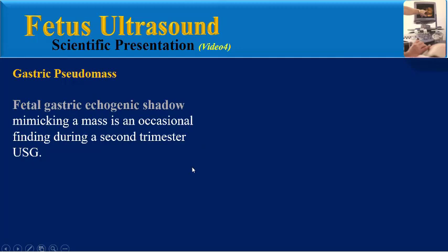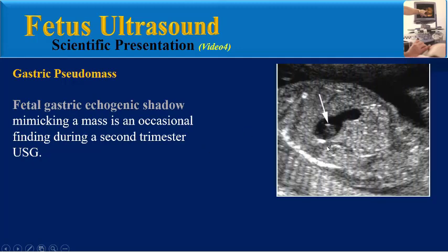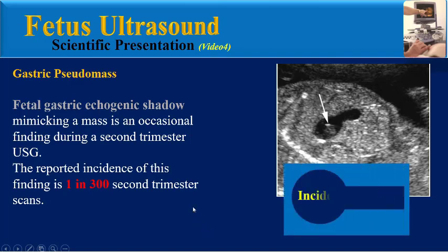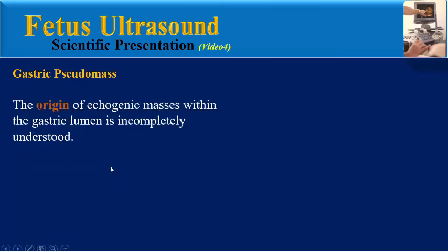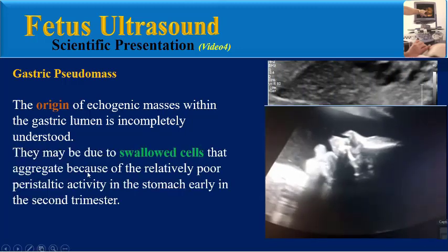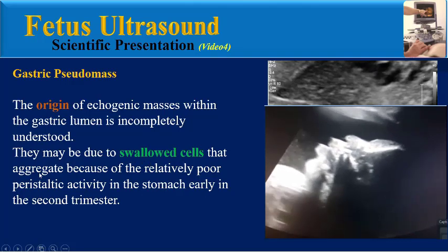Fetal gastric echogenic shadow mimicking a mass is an occasional finding during second trimester ultrasound. The reported incidence of this finding is about one in three hundred second trimester scans. The origin of echogenic masses within the gastric lumen is incompletely understood. They may be due to swallowed cells that aggregate because of the relatively poor peristaltic activity in the stomach early in the second trimester.